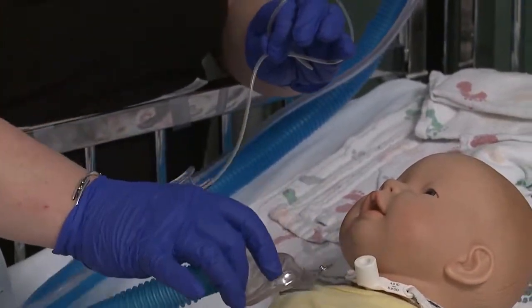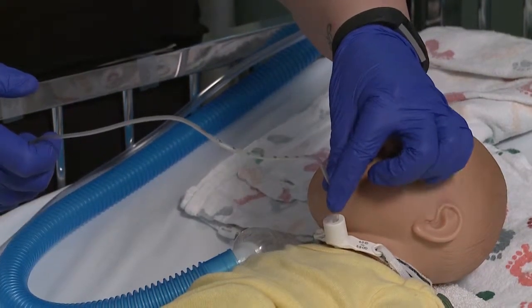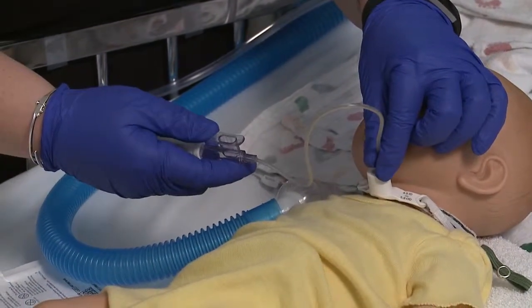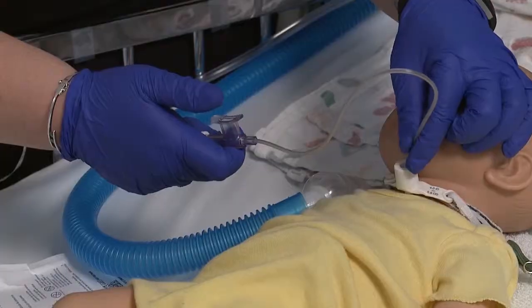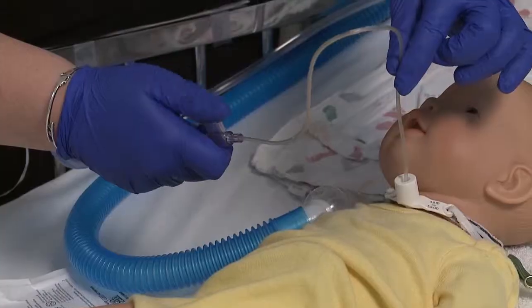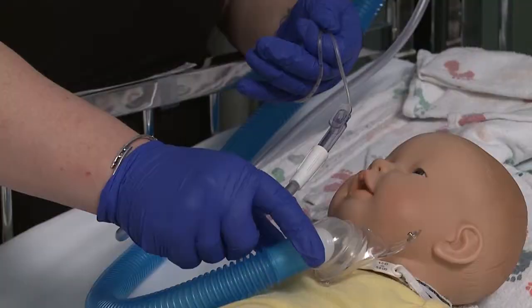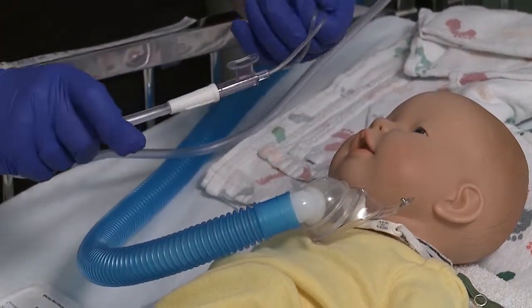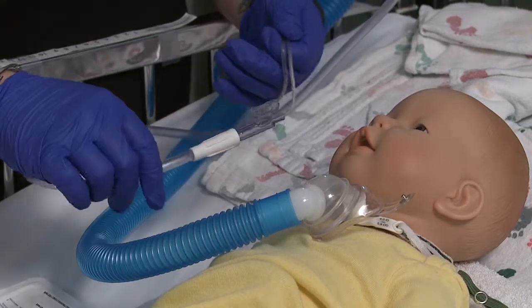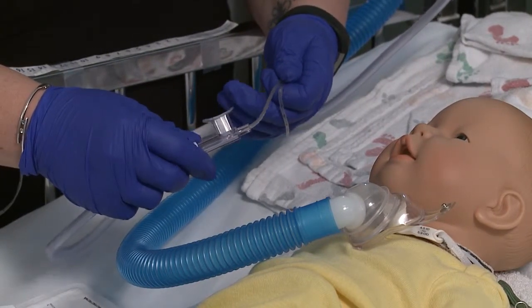Removing any mask that's on your child. You would advance the suction catheter down the tracheostomy to your safe suction depth, not applying suction at that time. As you withdraw the catheter, use suction coming out. You then place oxygen back on your baby if necessary and allow them to take a few breaths to recoup.